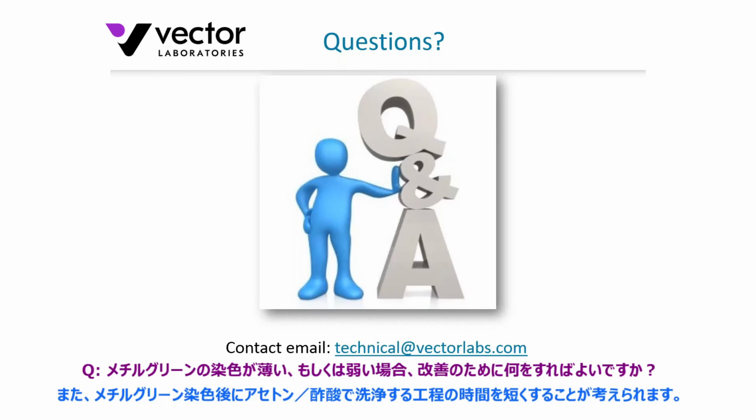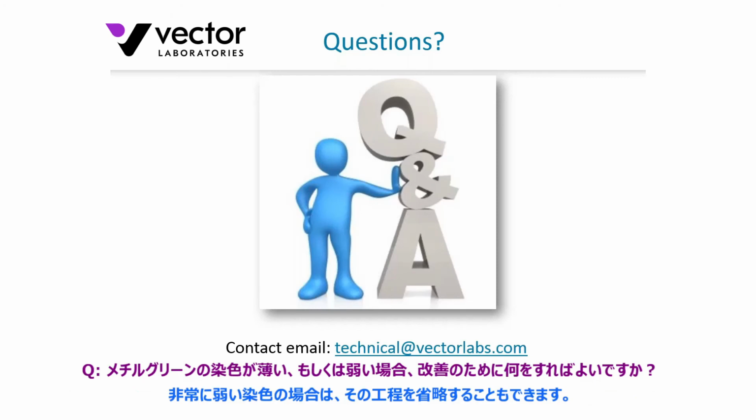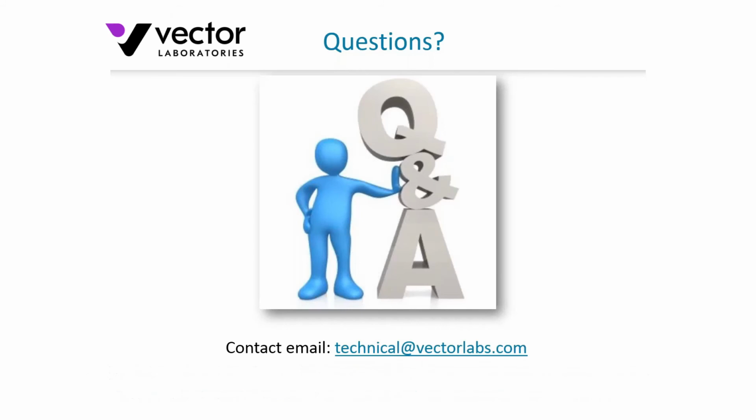Those can certainly be reduced in time, so you can reduce the exposure to those, or indeed in cases of very weak staining, you can even omit those just to retain maximal methyl green staining. So hopefully those couple of points will certainly help you out. The other point I'd have to say is just make sure that it doesn't look brown or off colored, and that the stock solution has that dark, deep green color to it.